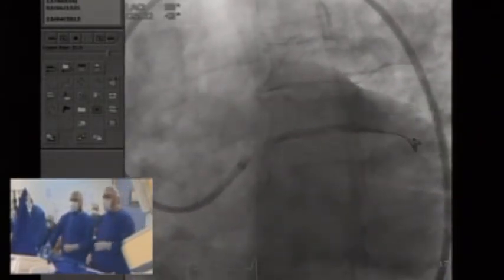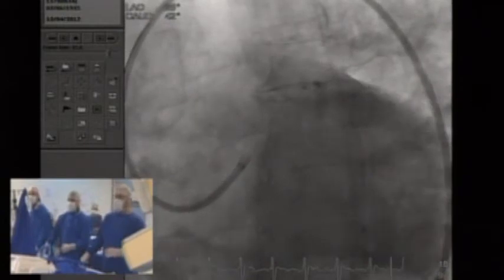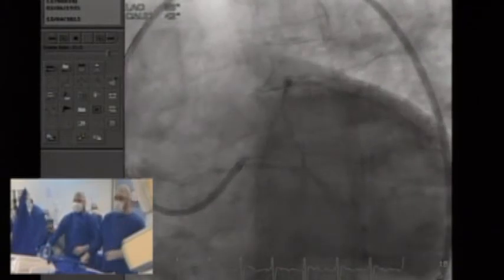Go. This is the direct stent. It's very easy, and this is the result. I don't think I will pass to OCT because you have to control the quantity of the contrast. Okay. Now I saw the result, and I think it's okay.